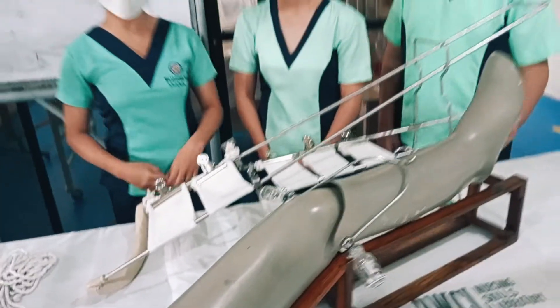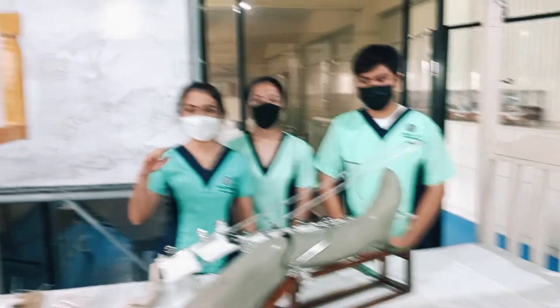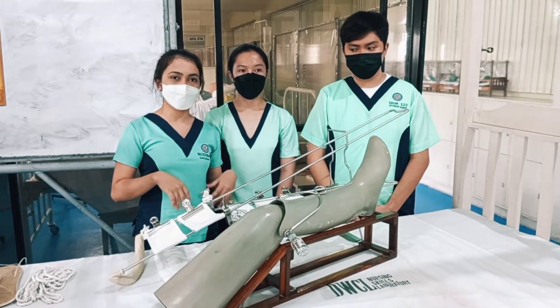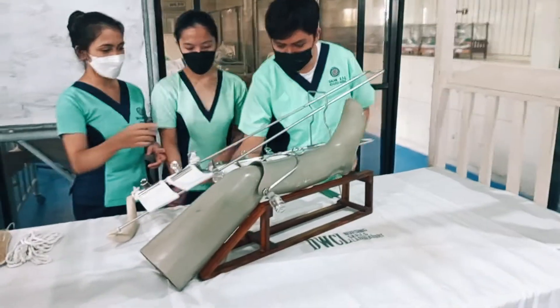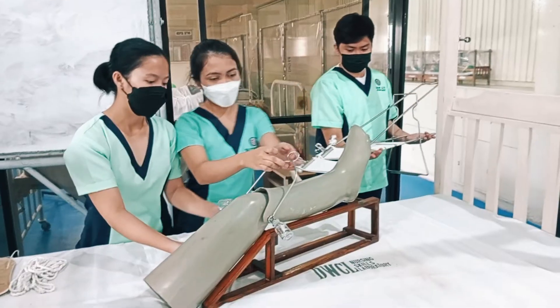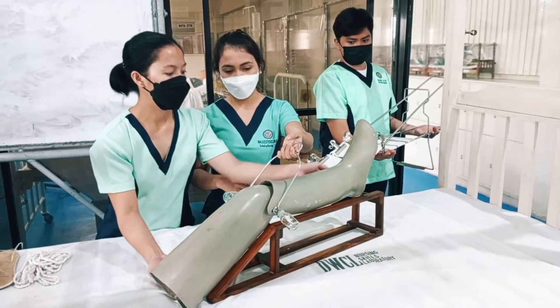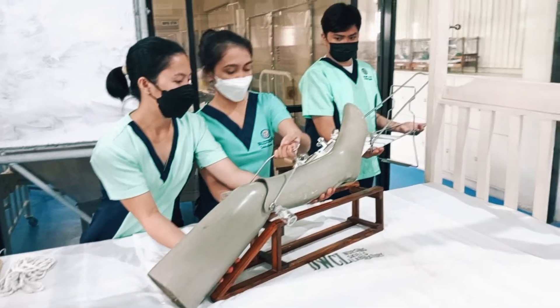After that, instruct the client to hold onto the overhead trapeze, to flex his other leg, and then to lift his buttocks off the top of the table. The count that should be applied at the same time: one, two, three.